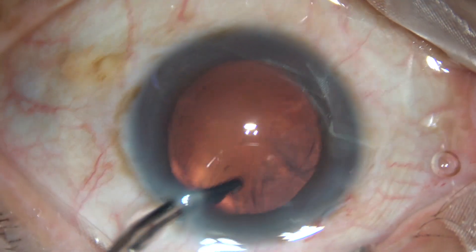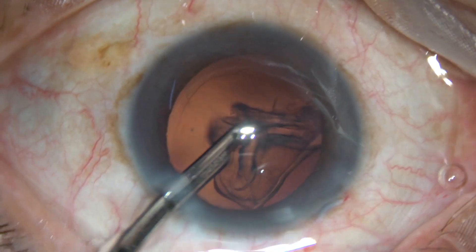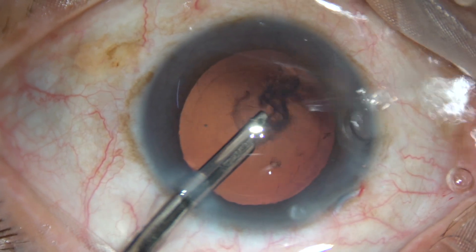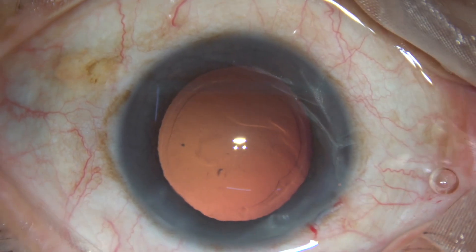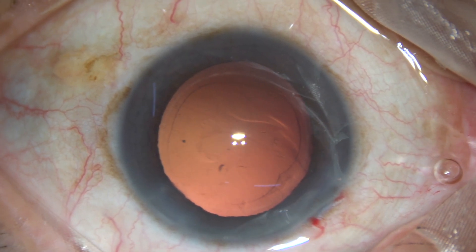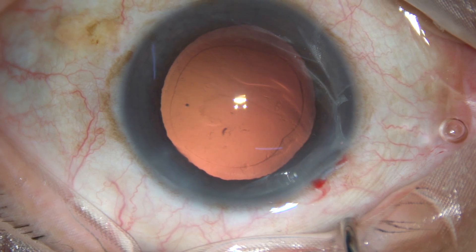Now go through the side port and remove the rest of the cortex. That's it — it is done with the 24-gauge Simcoe cannula. So in a jiffy, the cortex is removed.